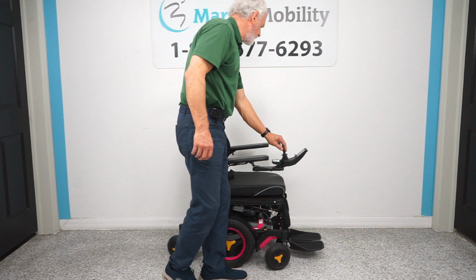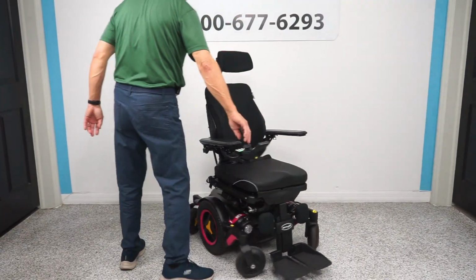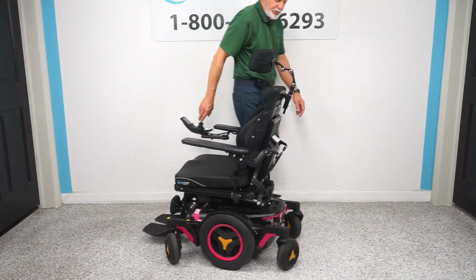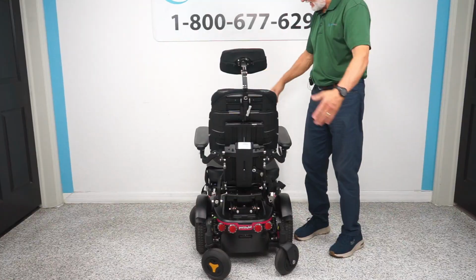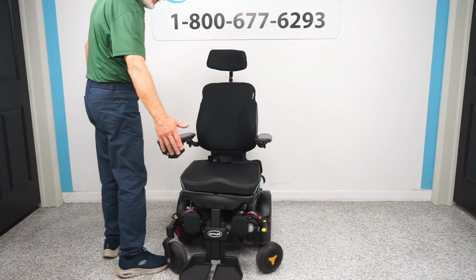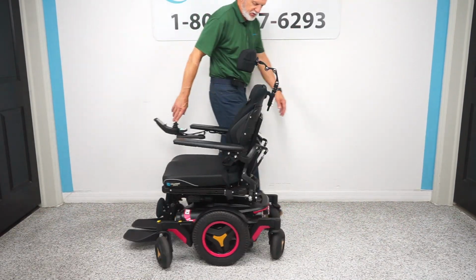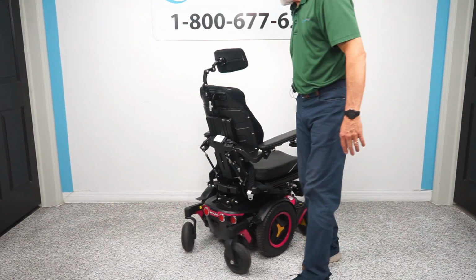All right, I just want to show you what your turning radius is in the house, okay? So if you're in the house, that's what you're looking at. This chair will turn on its own length. So whatever the length of the chair, that's what it needs to turn. And that's why you want the foot plates in. If they're all the way out, of course, you're going to be hitting everything. So that's your turning radius in the house.